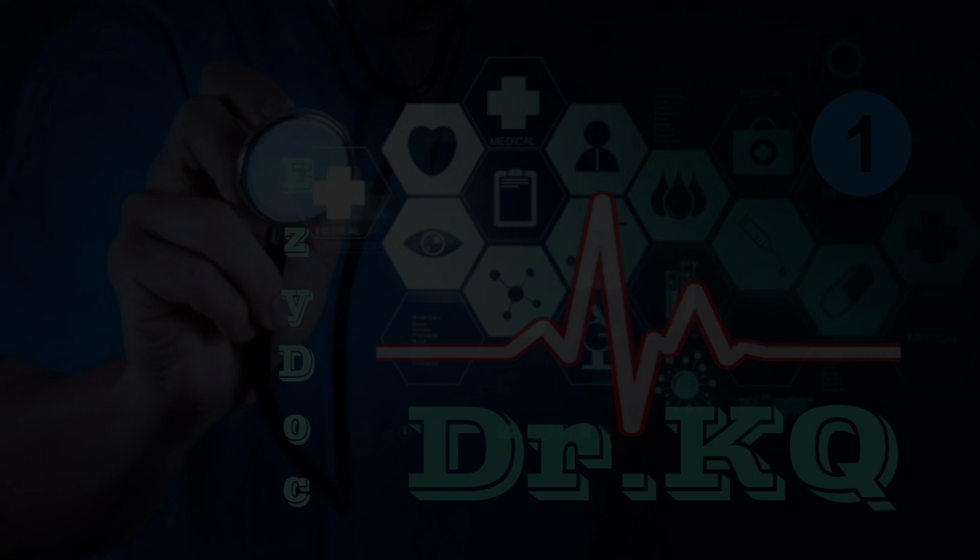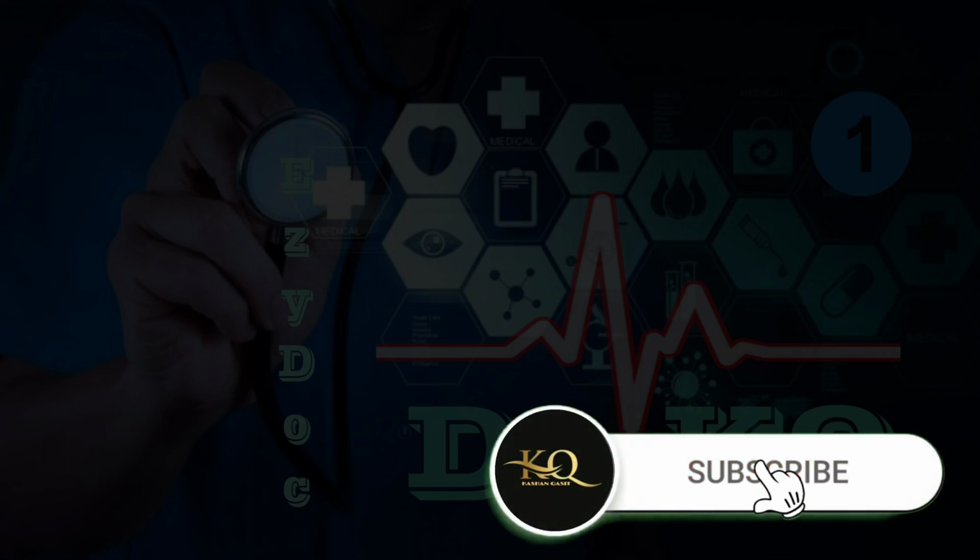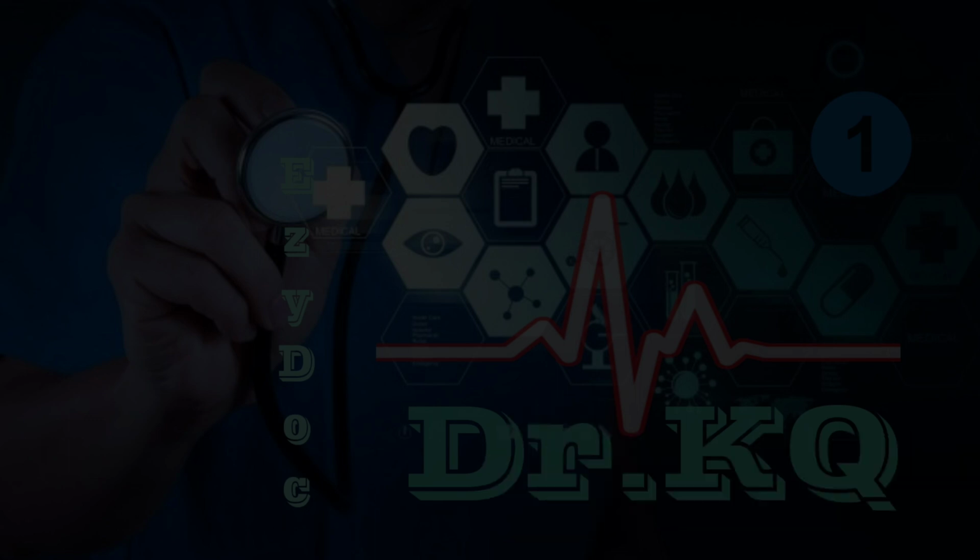Similarly, a tall T wave is also seen in prinzmetal angina, but don't confuse it with the hyperacute MI, because in that angina, when we take serial ECGs, there will be a fall of the T wave. The Q wave will never appear again and the enzymes will not be raised. So until now we have discussed the different ECG patterns and we have got a clear picture regarding the MI. And I hope you have got my point.